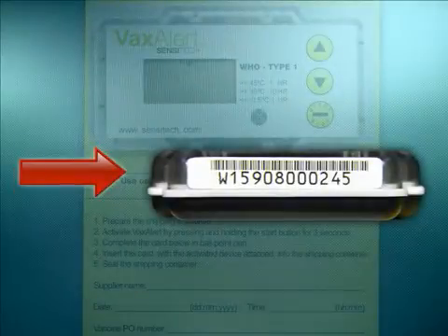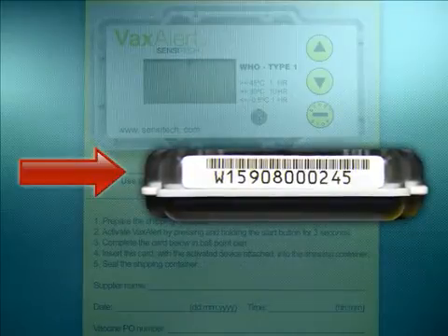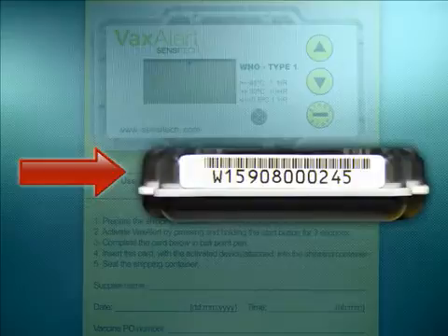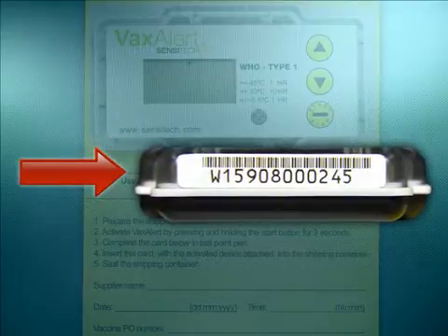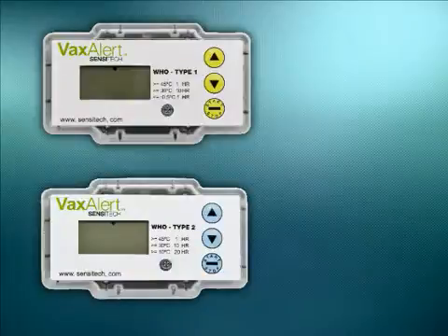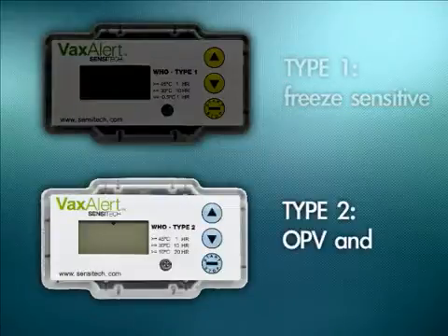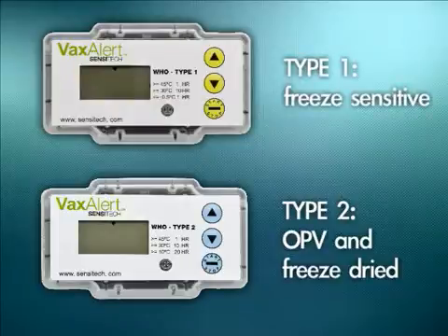Each Vaxalert device has a unique barcode. This unique barcode sticker should come from the vaccine manufacturer, along with a list indicating which device has been put into which box. There are 3 alarm conditions set within each device. Since Type 1 devices are for freeze-sensitive vaccines and Type 2 devices are for OPV and freeze-dried vaccines, the alarm settings for these two types are different.